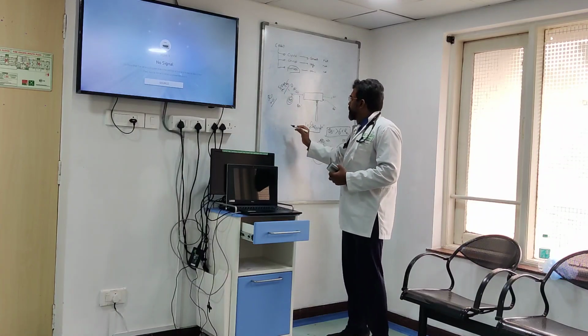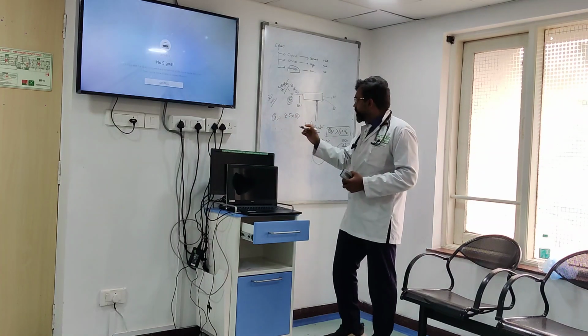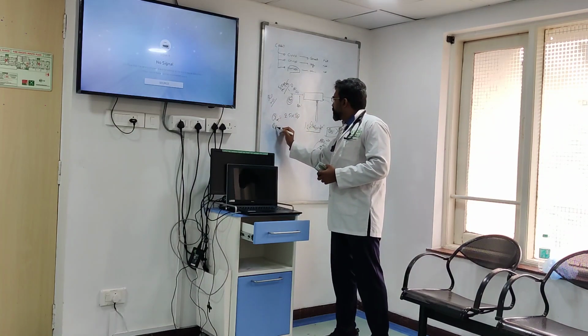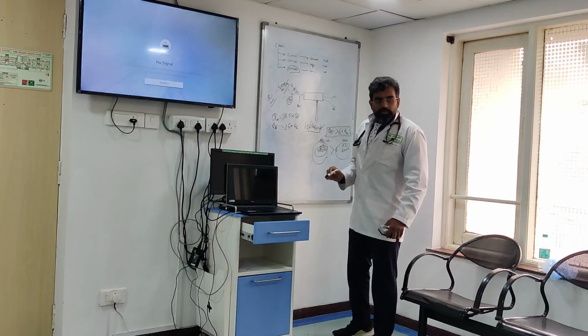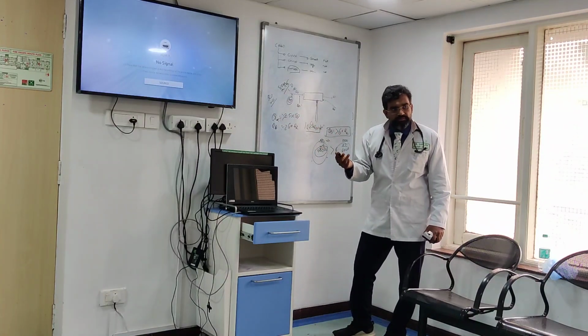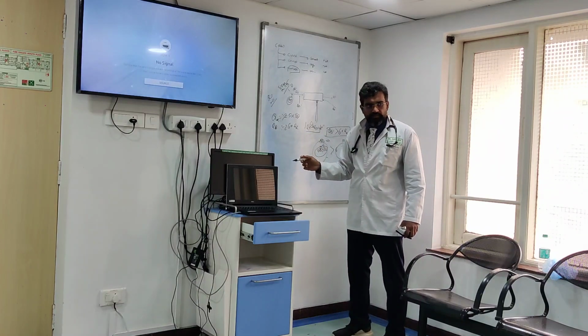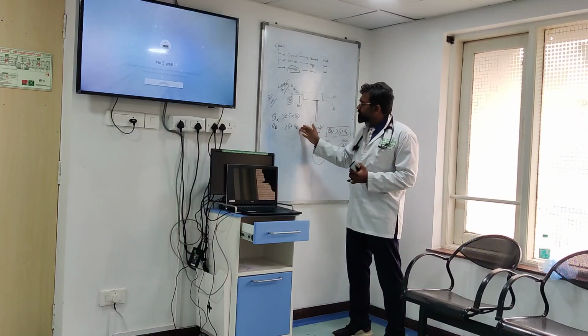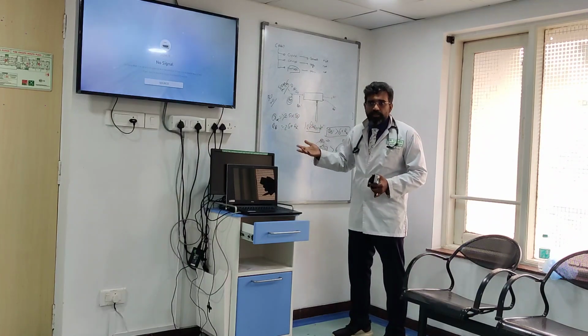Where you have this equation already in place, 2.5 into QD, and you have the other one where QB is equal to more than 6 times Q replacement. You have both here. So you take the larger. You take the larger of the equation, whichever is the larger variety. Can it be 1,000 only? This can be 4,000. This can be 1,000. We'll come to why you might change later on.